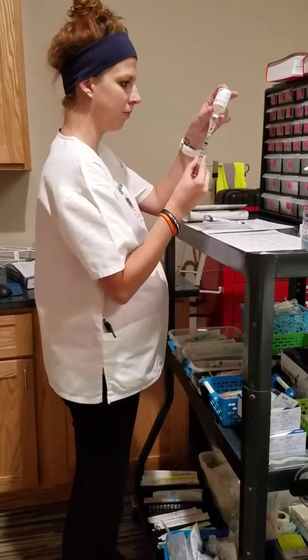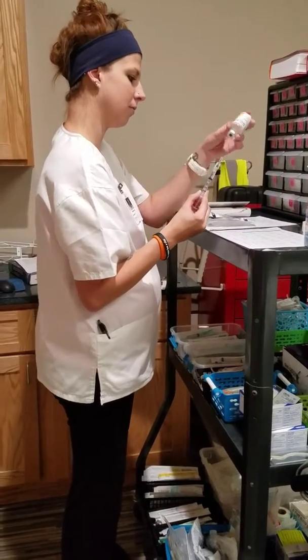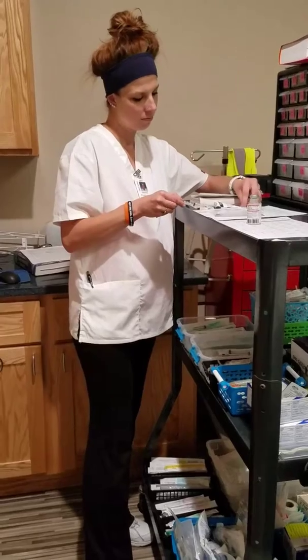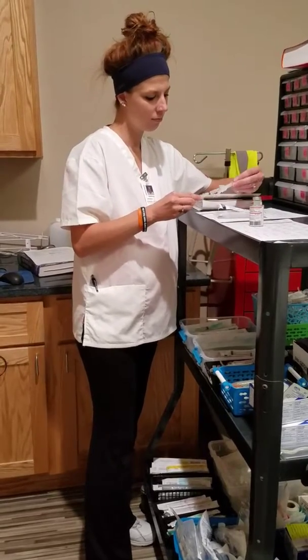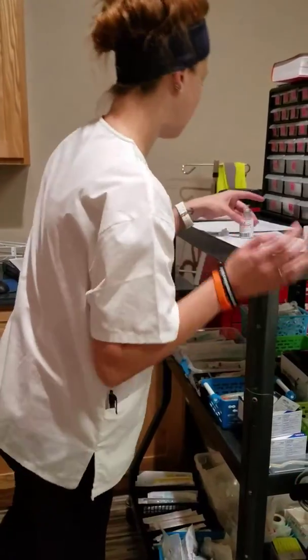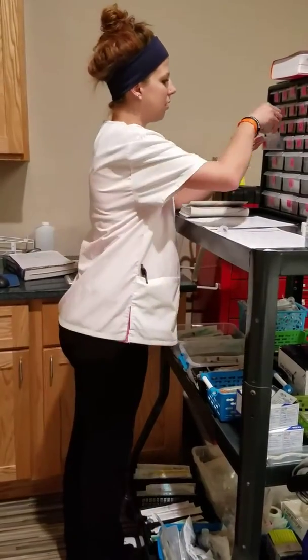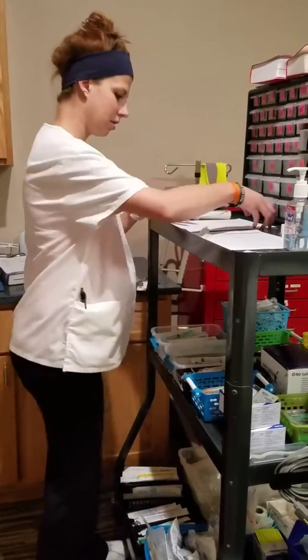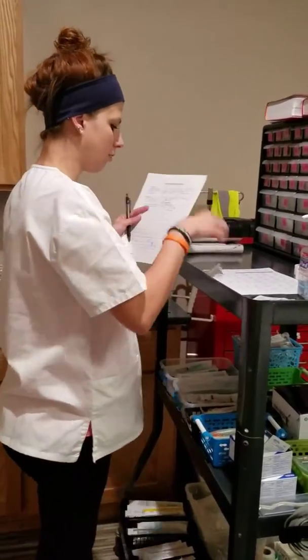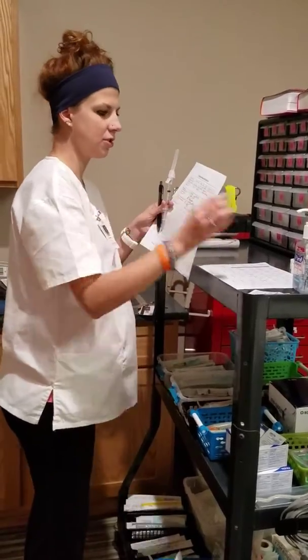1 ml. I'll put it that way. Let me put this back into D3. And now I go to the patient's room.